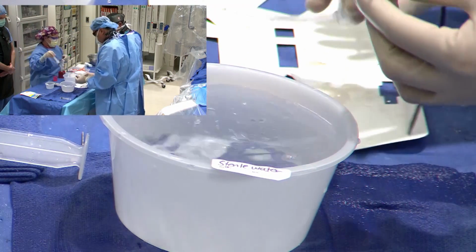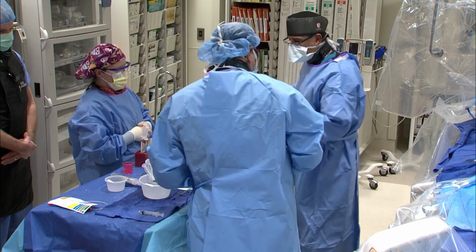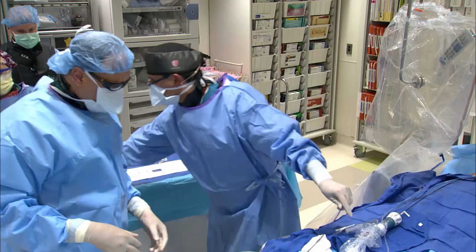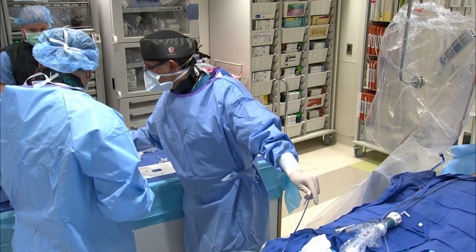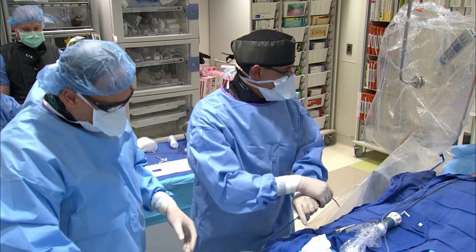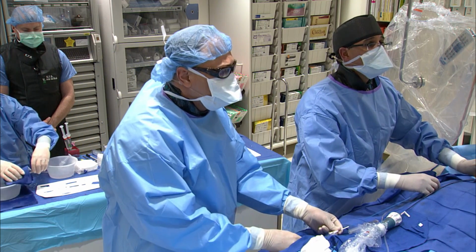So this eventually is going to enter through this sheath. We're now going to go ahead and put the sheath in. So this needs to stay in here. Karen, can you hold this there? Okay, great. Andreas, I'm going to get this balloon out. Fluoro, please.